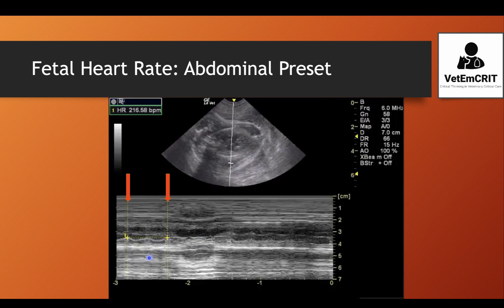You freeze the image in M-mode and will see the M-mode in a still image. Instead of choosing one cardiac cycle, you will need to choose two cardiac cycles. So this is systole of cardiac cycle number one — skip the next systole and choose the second systole, so your caliper will span two full cardiac cycles. As soon as you confirm the position of your second caliper, you will get the fetal heart rate, which in this case is around 216 beats per minute — pretty normal for a canine fetus.